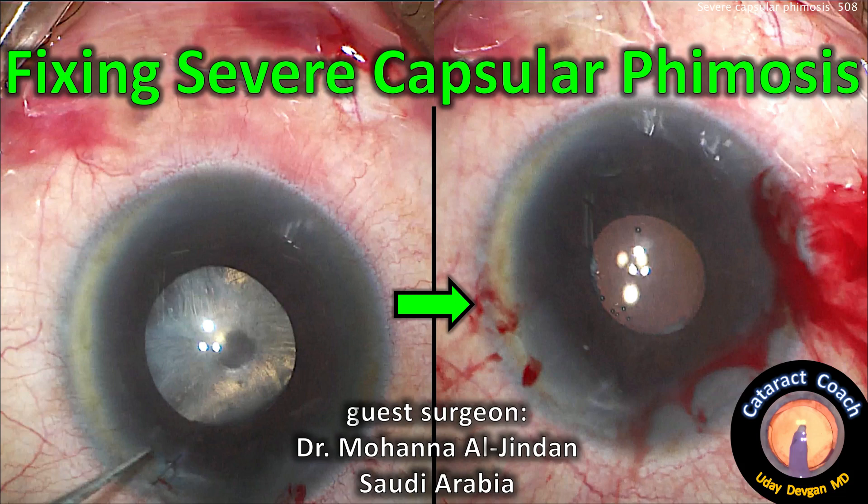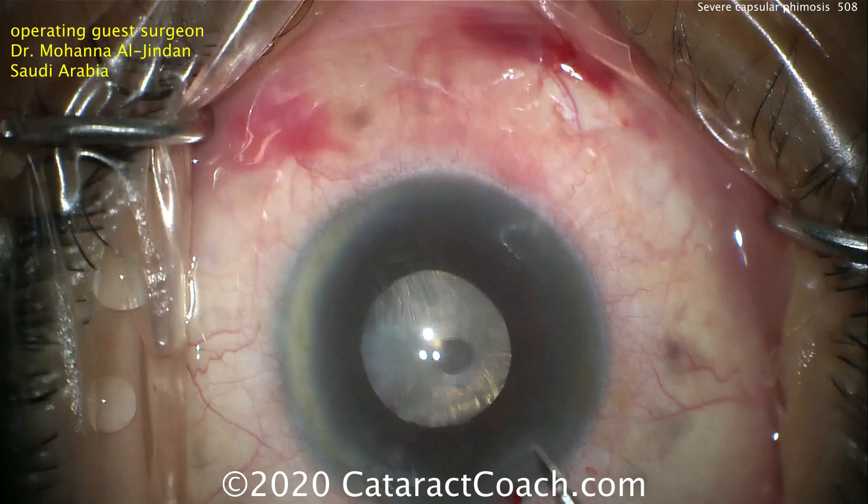CataractCoach.com, fixing severe capsular phimosis. Guest surgeon is Dr. Mohana Al-Jindan from Saudi Arabia.